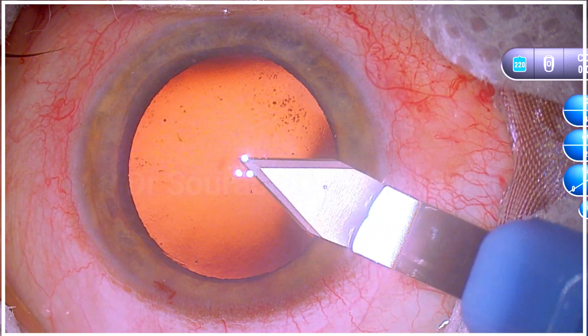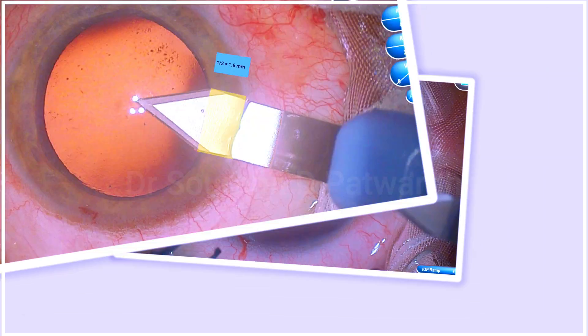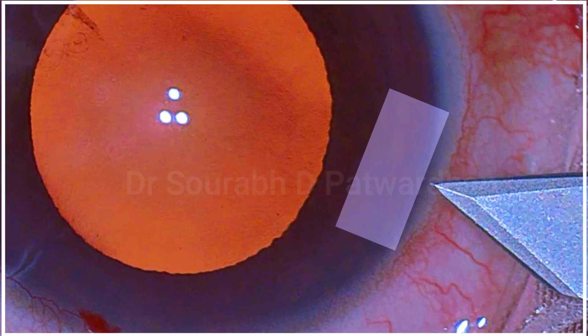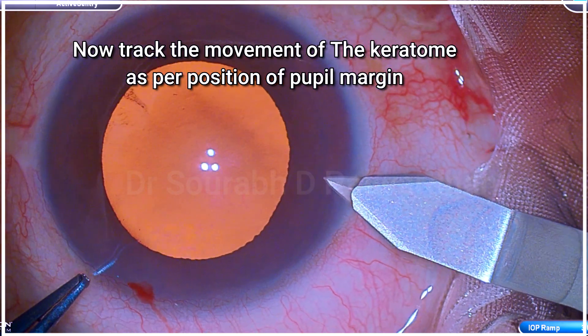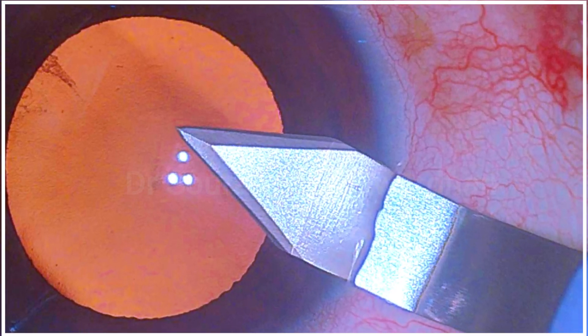I didn't realize this when I was operating — how I was tracking — but once I started decoding it, I realized this is how I was recognizing the pattern, and this is why I get more reproducible length of the incision. Looking at another case, you can see the iris is placed a little differently compared to the previous case. You can see that half of the iris is basically where the length of the incision is ending, and that's what I am tracking — and as you can see, I got it perfectly.